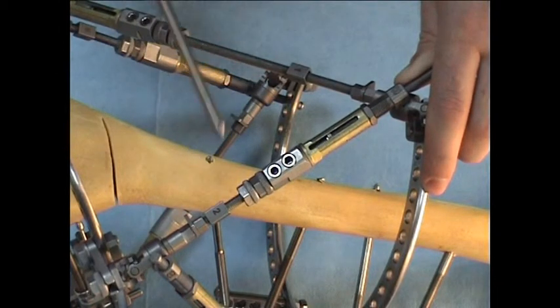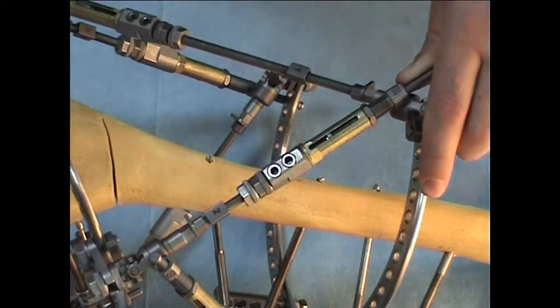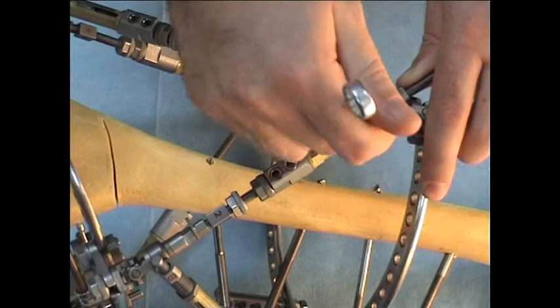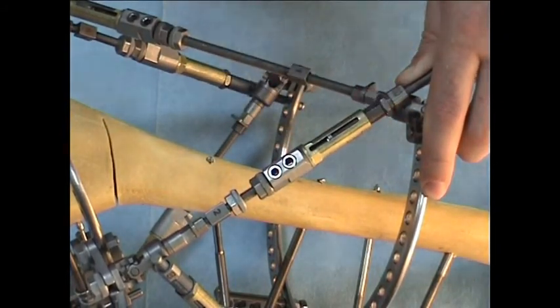For example, we have to lengthen strut number 2 by half a millimeter, or +2 in the schedule. First, we have to unlock the lock nuts. To do it, we first take the 12 millimeter wrench and unfasten the first lock nut, then the second lock nut.